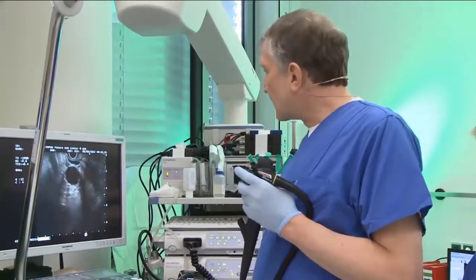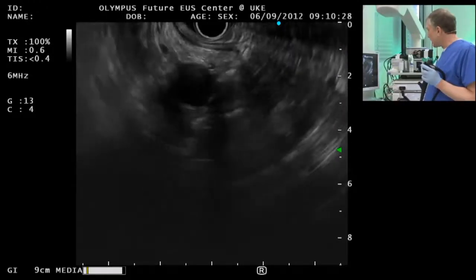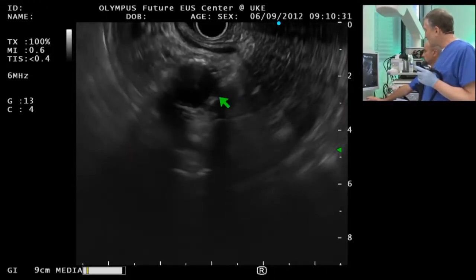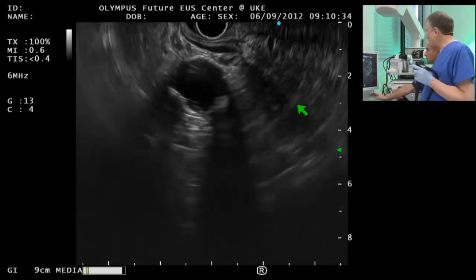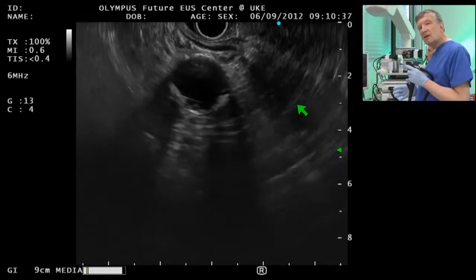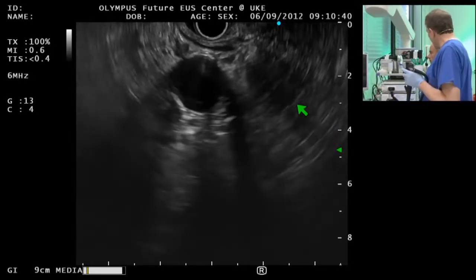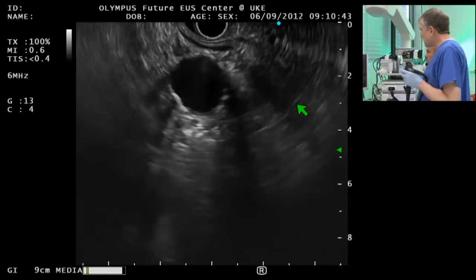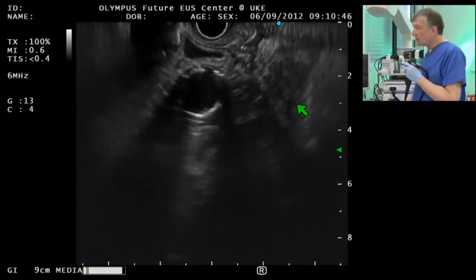I did radial EUS and the pancreatic head looked very inhomogeneous. I was not sure about calcifications and stones, and I think the message here is that if you have troubles with radial EUS, you can go to linear right away, because it sometimes has a different aspect. So let's start with EUS.